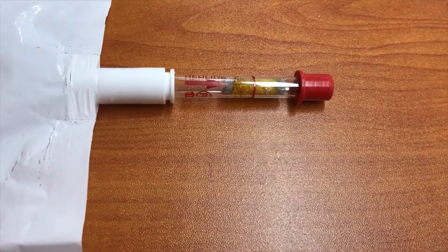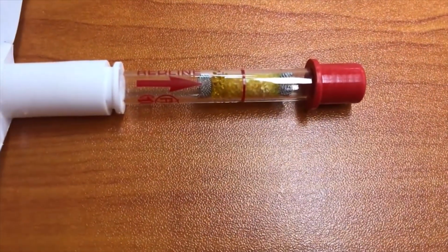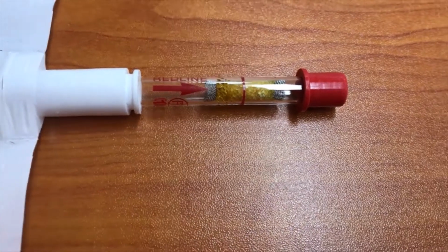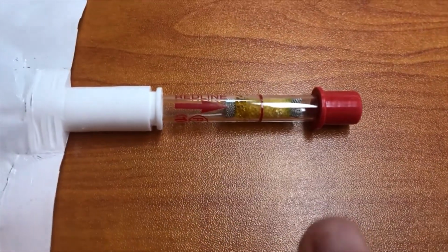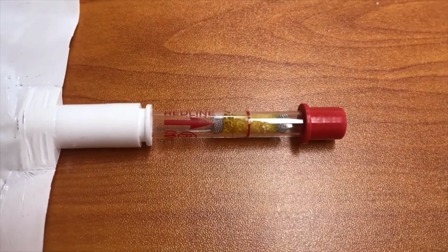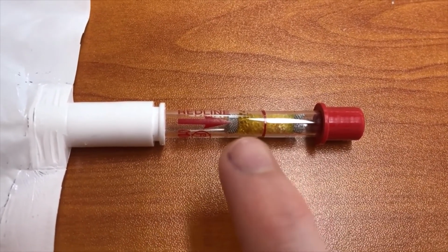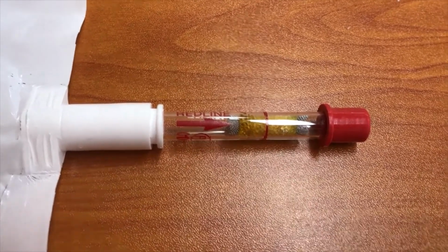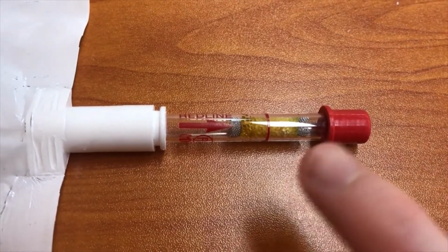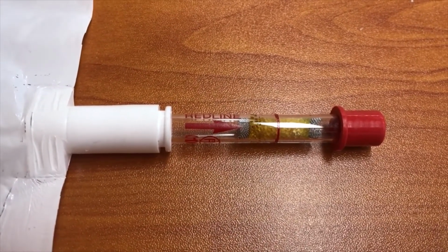Now what you were looking for is a change in the colour of the crystals from yellow to green. As you can see, that hasn't happened, they're all still yellow, which indicates that our donor has a blood alcohol content level of less than 0.02. This line arrow indicates which direction we're to analyse the results from, and this circle line here is the cutoff level. So below this line, if those crystals were green but not the crystals above the red line, that would indicate that the donor has a minimum blood alcohol content level of 0.02.